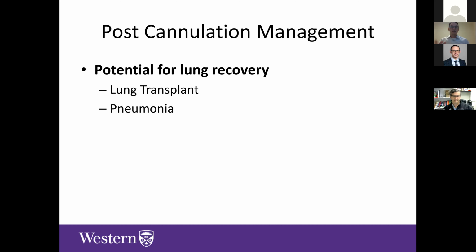And their lungs started to recover. So we switched to the ventilator. We stayed like that for a day or so. Their lungs seemed to tolerate safely providing gas exchange. So we decannulated them. So that would be the other extreme, where you have a really bad problem that's treatable and it rapidly gets better.